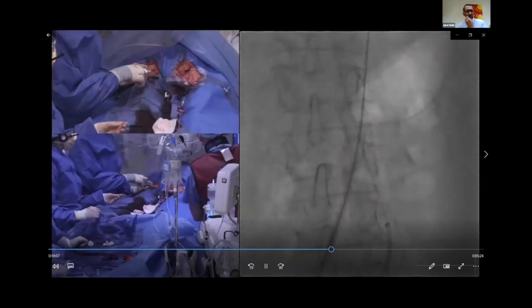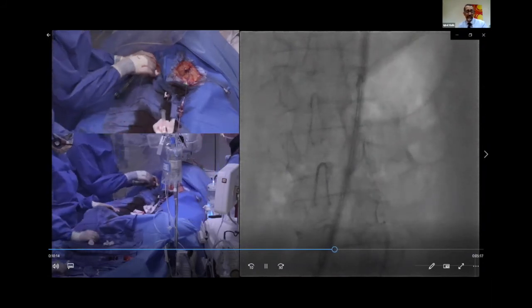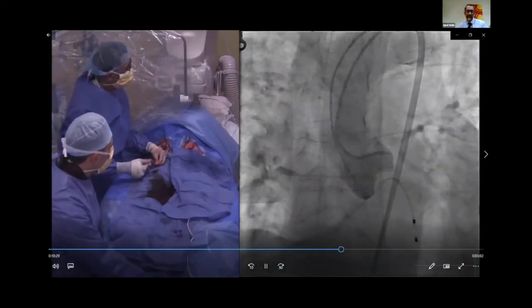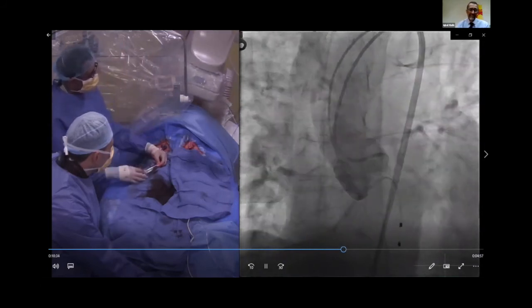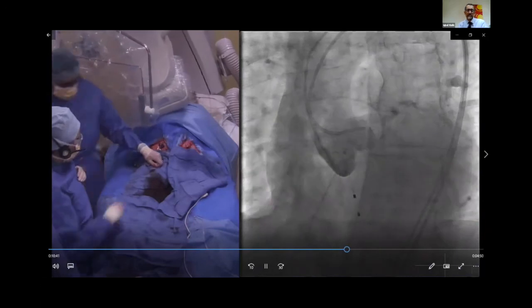The puncture point's been chosen from the CT scan, and I would certainly not, with my level of experience, suddenly change my mind and go somewhere else, because we've chosen that spot to be close between IVC and aorta, to have no bowel in between the two, to have a calcium-free spot. If it's a small change of angle, that's fine. But choosing a fresh spot because you think you can find a better spot in the cath lab would be very dangerous, because you've planned it with your covered stents and your puncture point specifically from the CT.